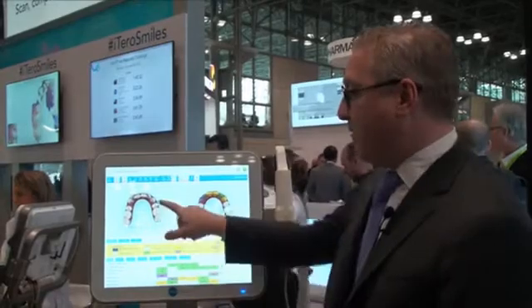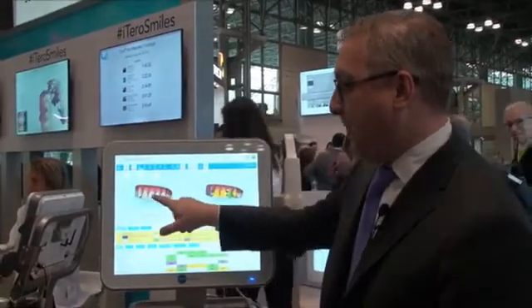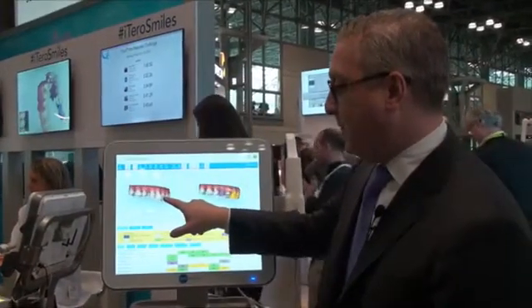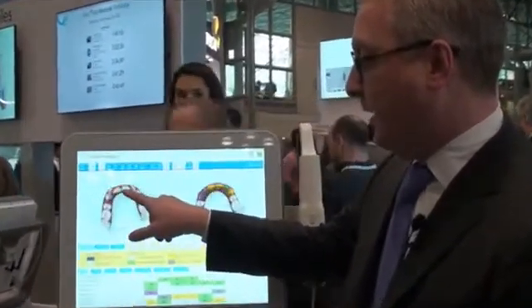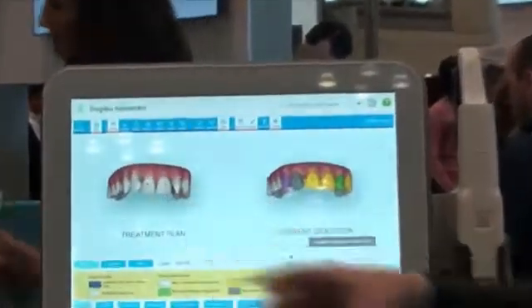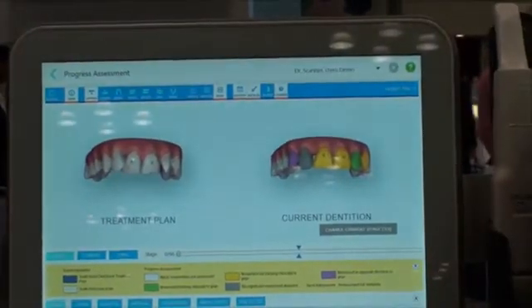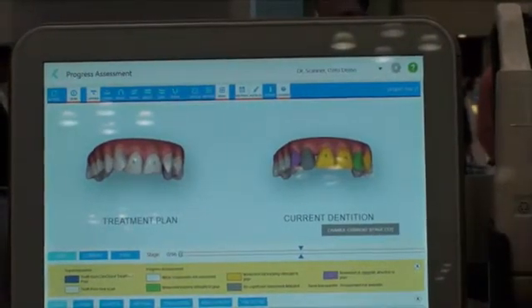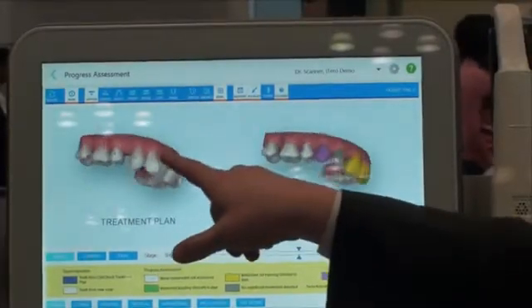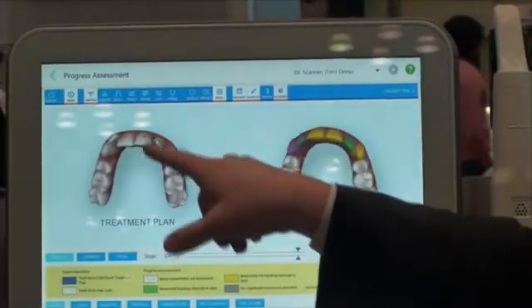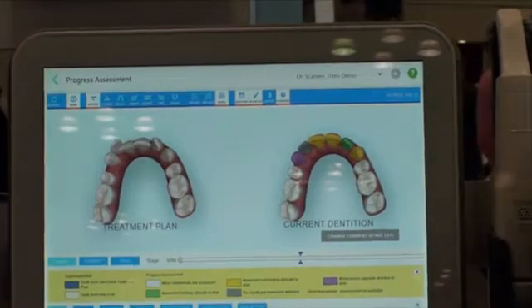Number one: when you scan, it now comes up in full, regular tooth color and gum color. It used to come up in yellow, like a stone model. Now when you scan people, it comes up in the regular color, so it's much more impressive to both doctor and patient.